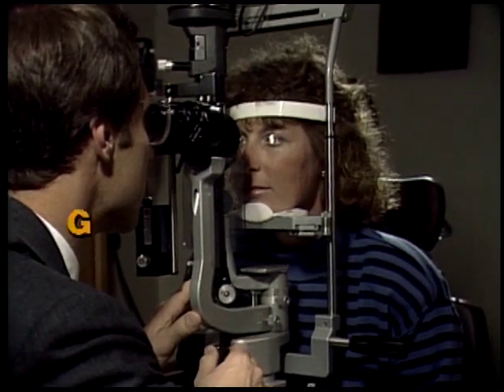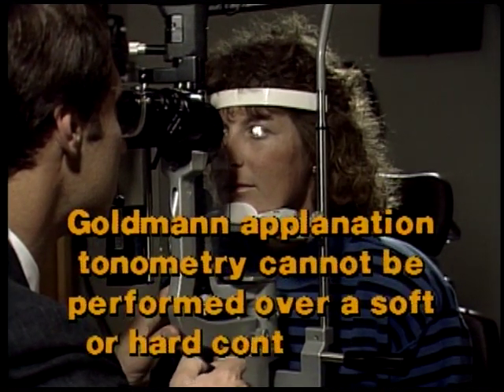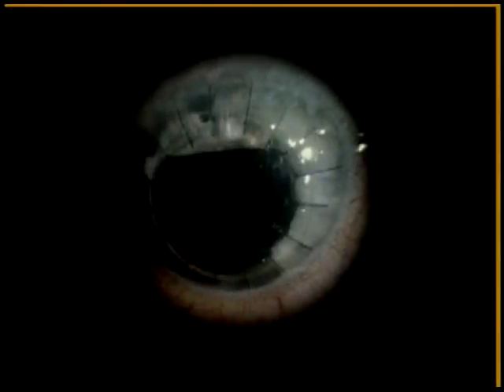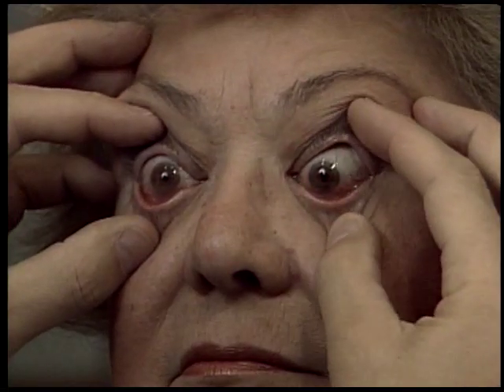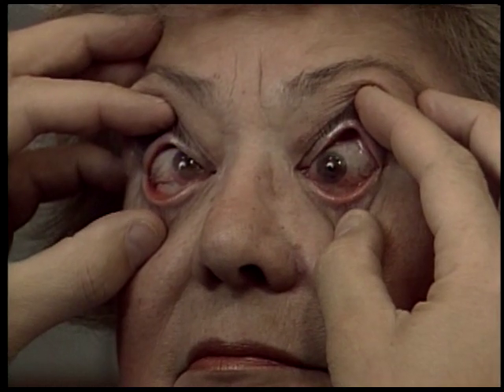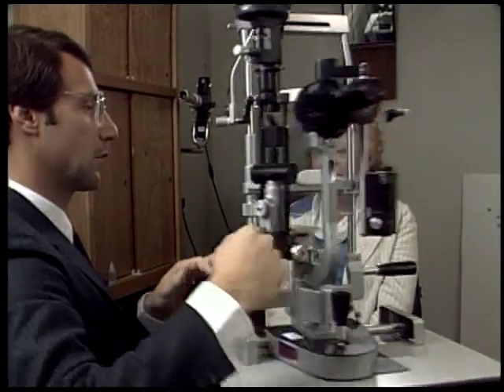Unlike some tonometers, Goldmann Applanation Tonometry cannot be performed over a soft or hard contact lens. Patients with marked corneal swelling from trauma or surgery may also be difficult to check. There are some ocular conditions where intraocular pressure may need to be checked with the globe rotated out of primary gaze. For example, in patients with thyroid eye disease, intraocular pressure may be higher in upgaze.